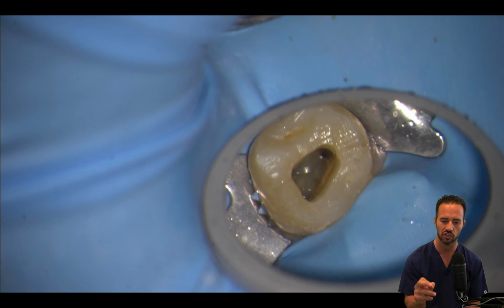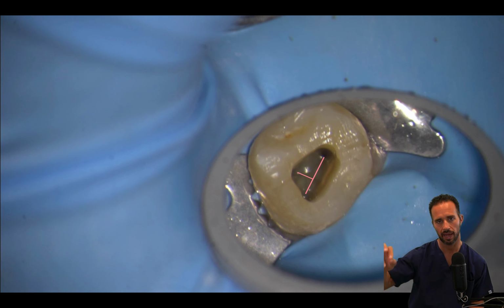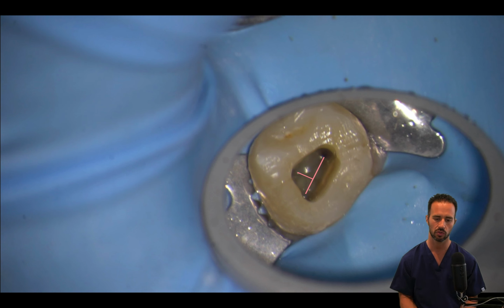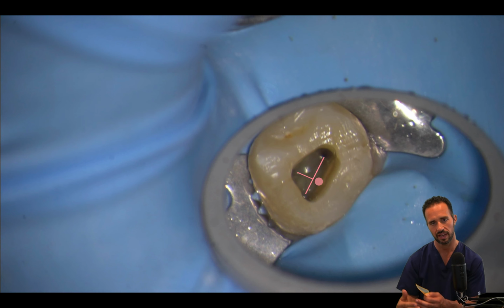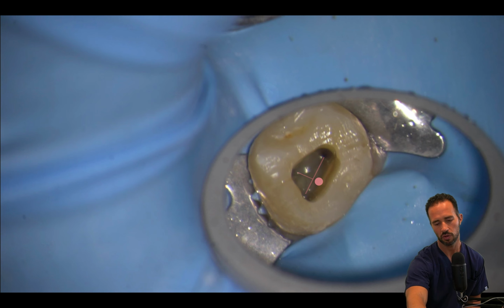And if you draw an imaginary line from the mesial buccal canal to the palatal canal, you use that as your guide. And then you look at where the distal buccal canal is, and you draw a line perpendicular to that MB to palatal line. That should be your approximate location of your MB2. It's going to actually be slightly more mesial to that intersecting line, but that's going to be the location of where you're going to be looking for your MB2. And we want to make sure that there's no dentin covering over the MB2, and so that's what we're going to be doing for the next few minutes of the procedure.